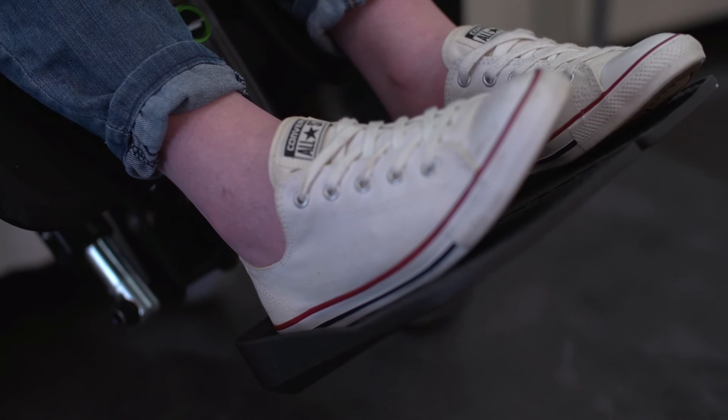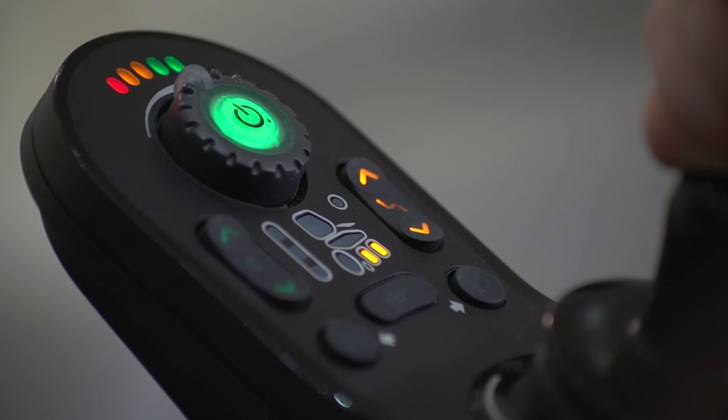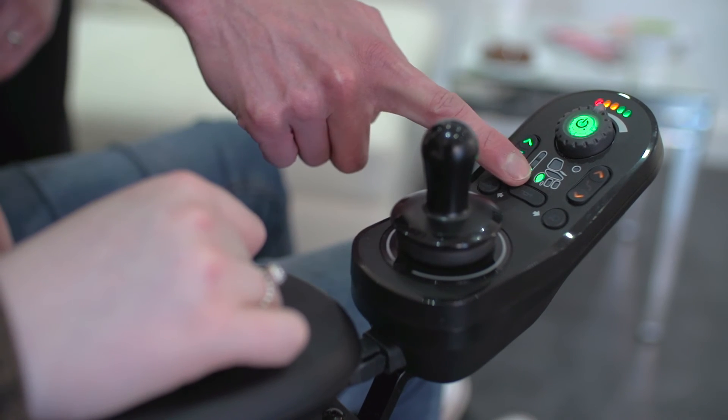The movement is proportional to the joystick deflection, meaning the further the joystick is pushed, the faster the movement. To exit out of seating mode, simply click on the drive button which will highlight the drive function button.